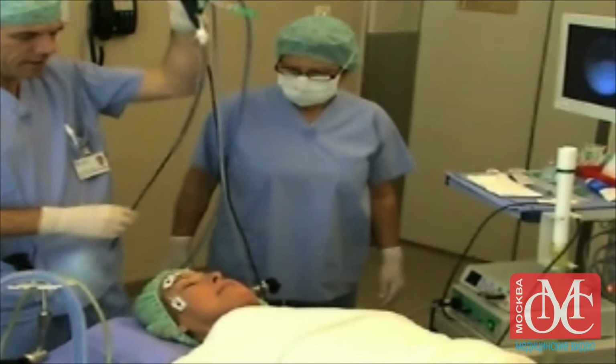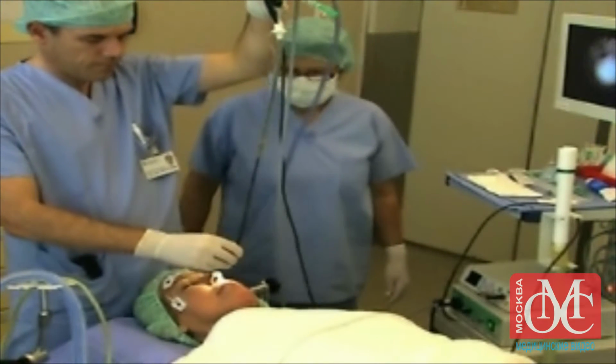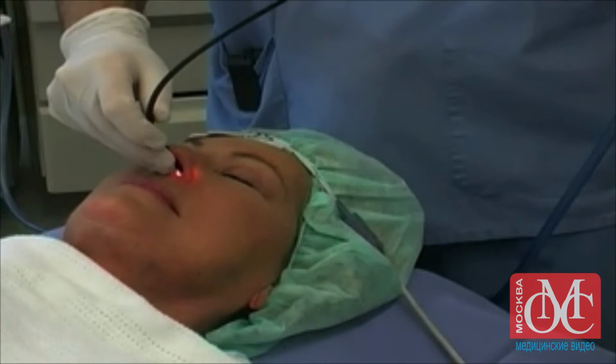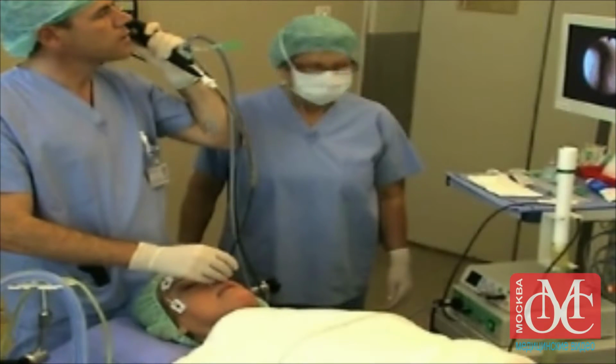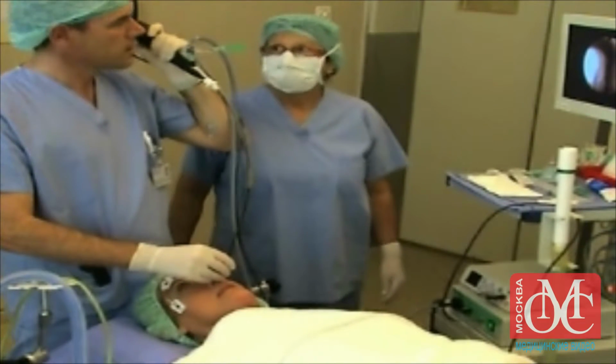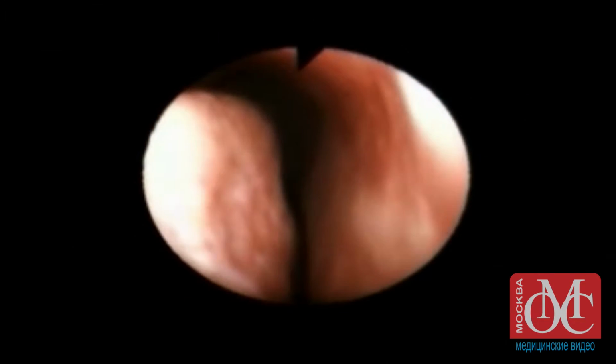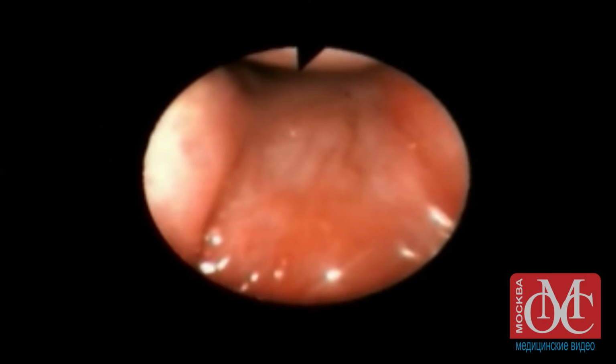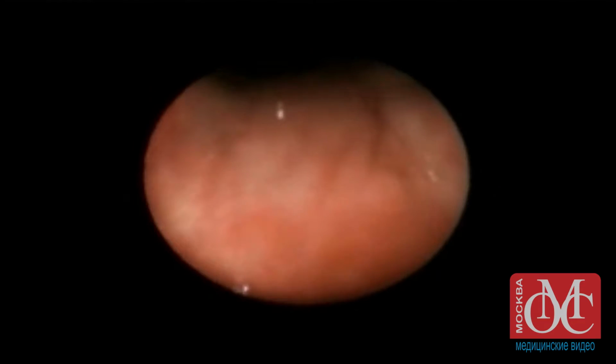Stand above the patient's head and explain each step as you proceed. Hold the fiberscope near its tip in order to get the best feel for the instrument as it proceeds through the lower nasal passage. Direct the fiberscope parallel to the patient's nasal floor. By constantly keeping the floor of the nasal cavity in view, you will prevent upward movements of the fiberscope, which directs it towards a blind recess.